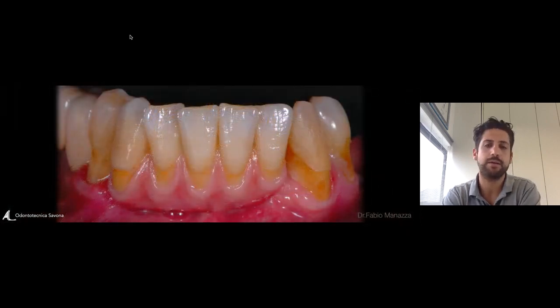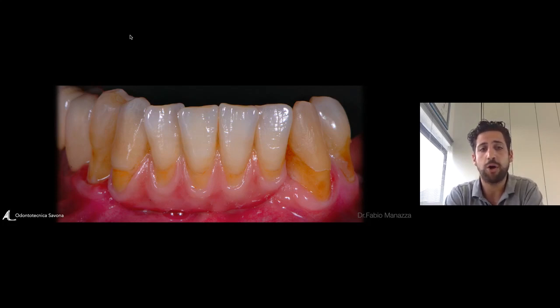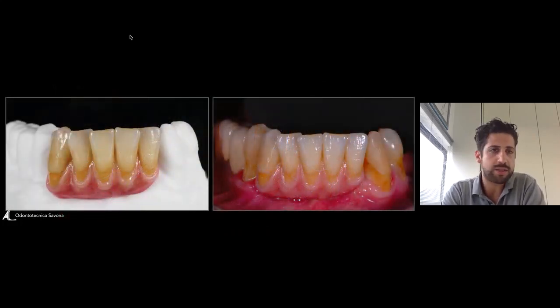And this is the final situation in the mouth, okay? With respect to the prototype, the color is much better. The color between the two canines is more similar. Also the root is really similar. We applied some stains with the orange. Even the gingiva, I think, is quite good. The most important thing is the patient was happy, and also the doctor was happy with this situation. This is also a nice picture because it shows the precision in our model and in the mouth of the patient.